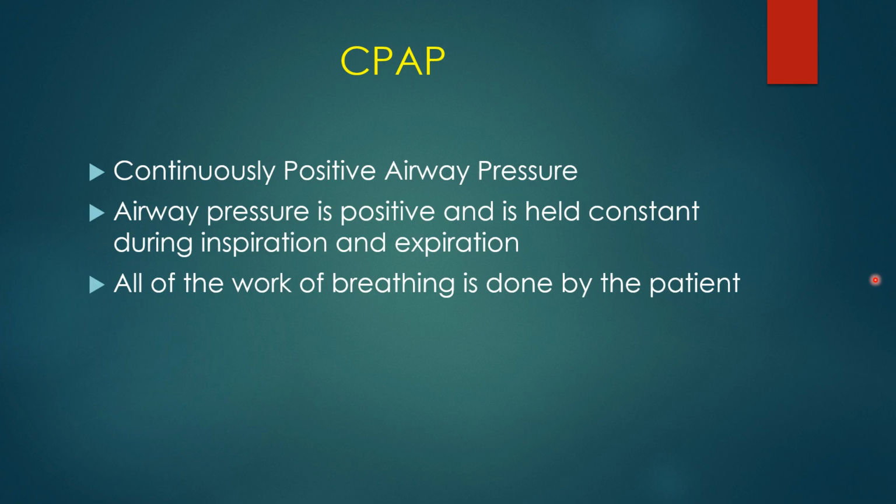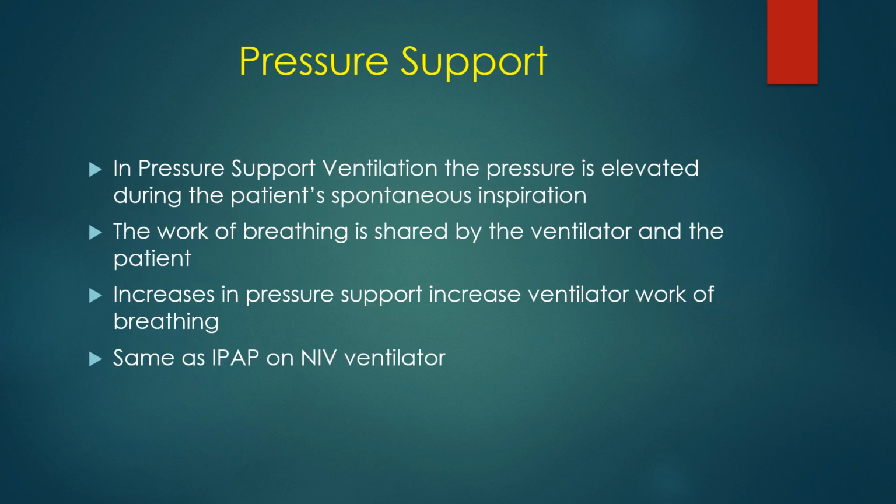And the important thing to remember here is that all the work of breathing is done by the patient. This does not help the patient to breathe. If he has high airway resistance or low compliance and he has to work hard to breathe, the CPAP probably isn't going to be of much help for that. He needs either pressure support or to be put into some control mode of ventilation. The pressure support is, as I said, the work of breathing is shared between the patient and the ventilator.